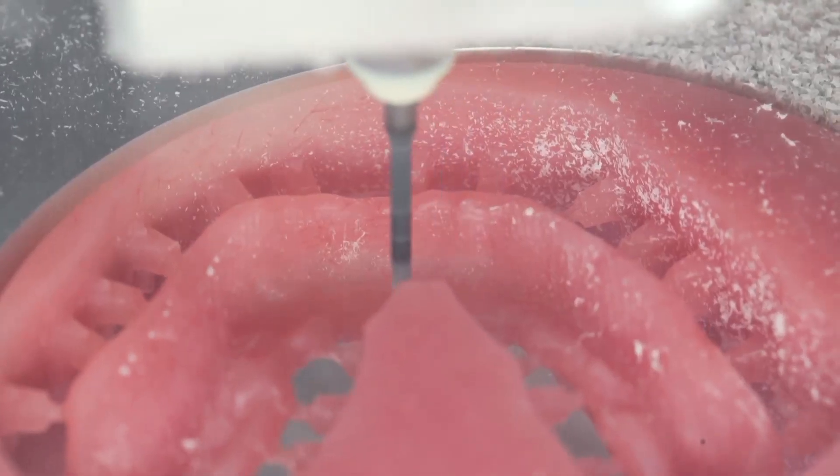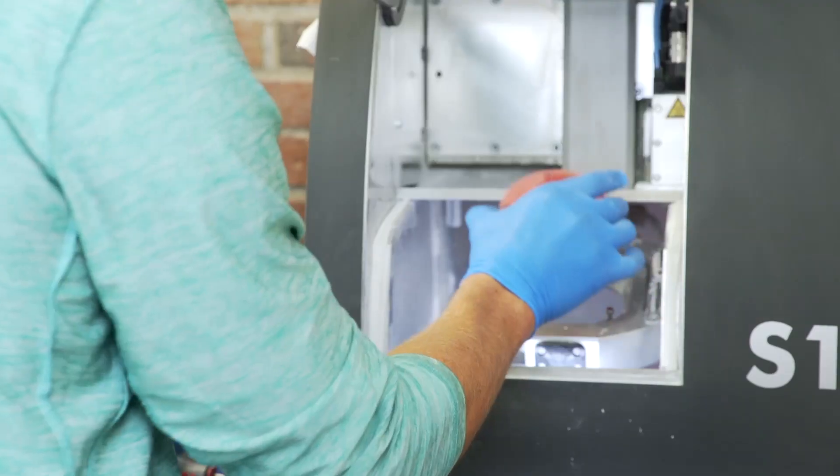When finished, a perfect denture frame is ready for polishing, tooth placement, and finishing touches.